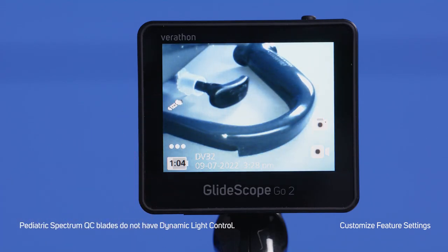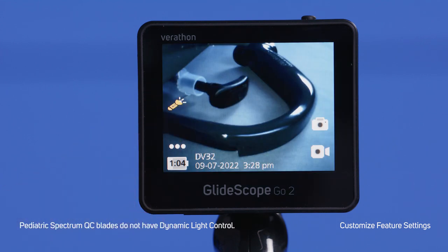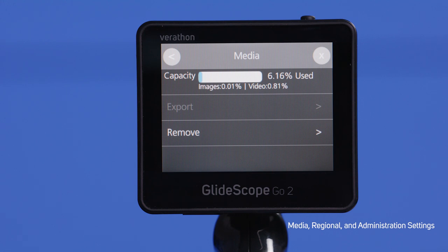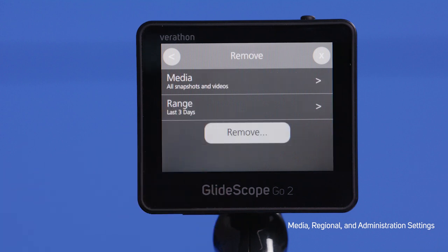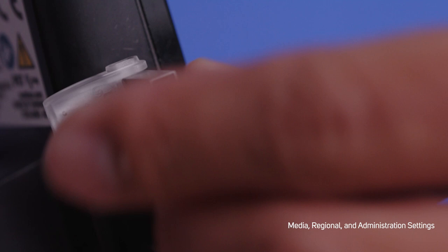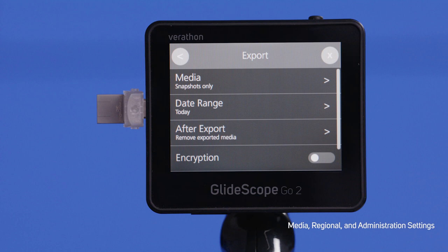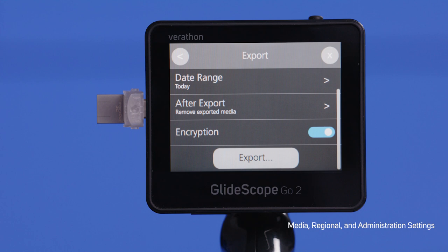When using GlideScope Go 2 with Spectrum QC, dynamic light control can be turned off and on. To do so, click the icon directly on the home screen. Under Settings, click Media. This will take you to the screen to export and remove media from the device, and you will also see how much storage you have used. When removing media from the device, you can choose to delete all snapshots and/or videos and specify the date range. When exporting media, first make sure you have the USB-C plugged into your GlideScope Go 2. You can choose the media type, date range, and what to do with the media after exporting. If you toggle the encryption button on, you can encrypt your export so the encryption code will be required to view the media later.